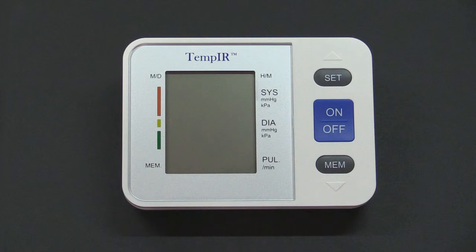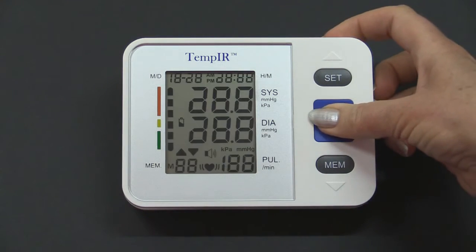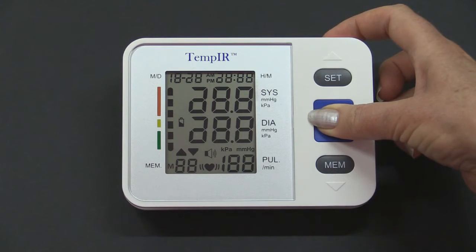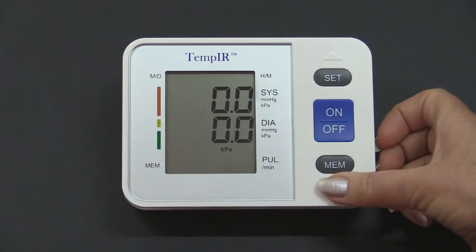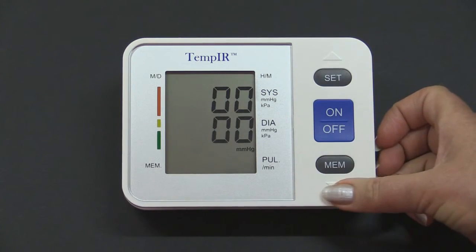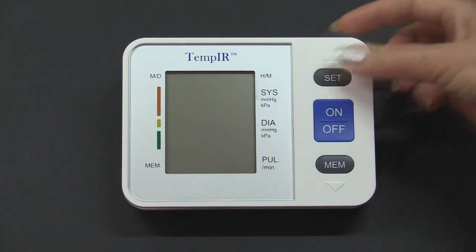Blood pressure is generally measured in units of MMHG, which historically means millimetres of mercury. This monitor can also display readings in KPA, which is kilopascals. To select which units you want to display, press and hold the on-off button for longer than 5 seconds until the screen changes. Click Mem to select, and finally Set to store the change.